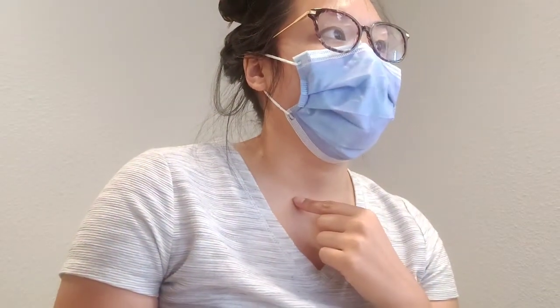Next question. When scanning a head with IV contrast, a scan delay of blank is recommended. Okay, I contemplated on this one too, but I think the longer the better, because when you're scanning a head, you want the contrast to go through your blood-brain barrier, and that takes a really long time. My facility, we actually scan at like 2 minutes, and I feel like that's too short, because you normally give a CT head scan with contrast for IV patients, any infections, any malignancy and stuff like that. So a longer delay is better for your brain.